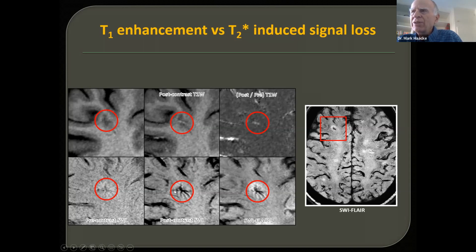And here you can see what we call a developmental venous anomaly. It's actually like a micro DVA. It's very small. And if you draw a circle around that, lo and behold, that's exactly where the lesion appears in the FLAIR images. So it's very interesting that this vascular anomaly correlates with the development of white matter lesion. Now, we don't see that in all these lesions because you can see this individual here has other lesions, but you can see what's called the central vein sign associated with that lesion.